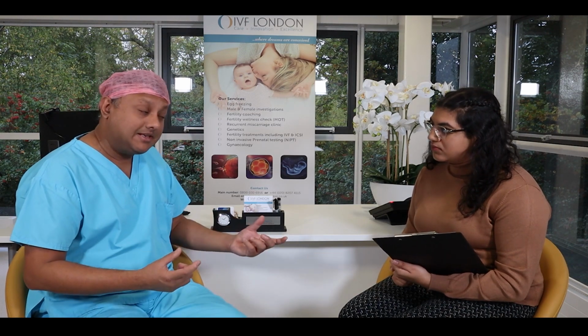And so what information does an embryoscope provide? So an embryoscope is an incubator which is equipped with a camera. So when, as I said, when we inject the eggs, we would put them straight into the embryoscope, which is a culture incubator, so it keeps the embryos culturing for about a period of 5 to 6 days. And daily, the embryos will be checked. And not just daily, their embryos are checked every 15 minutes per se. So the camera in the embryoscope takes an image of every embryo for that patient every 15 minutes.